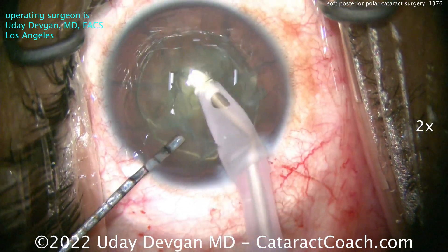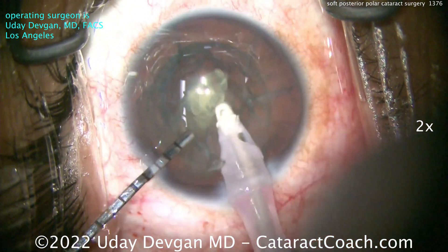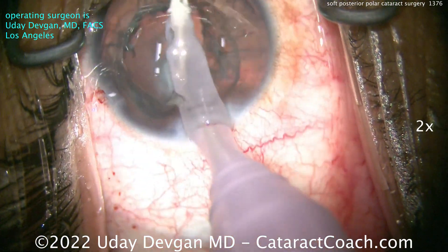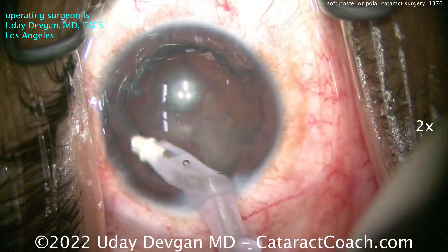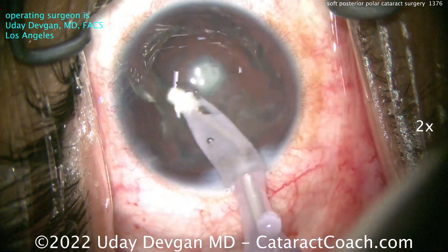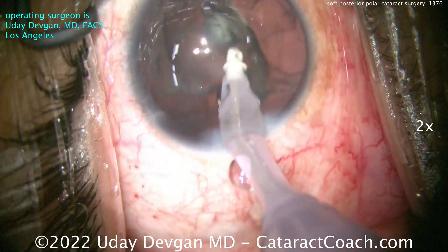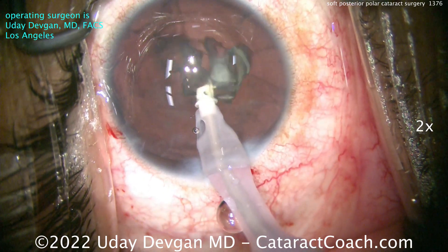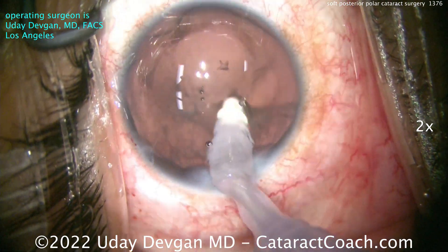It's pretty soft, so we'll just vacuum out this nucleus and be very cautious. There was no hydrodissection, of course, because we don't want to cause a rip in the posterior capsule. We want to get this whole big sheet of epinuclear shell and maybe some cortex up. As I'm doing this, I'm watching back there, making sure that posterior capsule is not going to pop open on us. Nice and easy, taking this out.